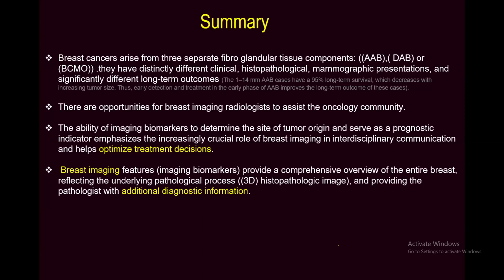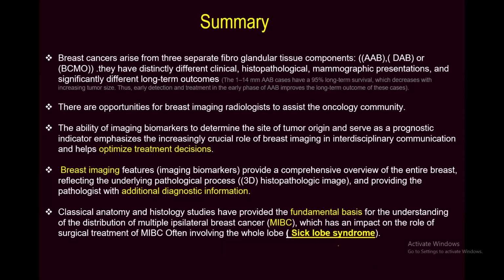Breast imaging features, or imaging biomarkers, provide a comprehensive overview of the entire breast, reflecting the underlying pathological process, 3D histopathological images, and provide the pathologist with additional diagnostic information.